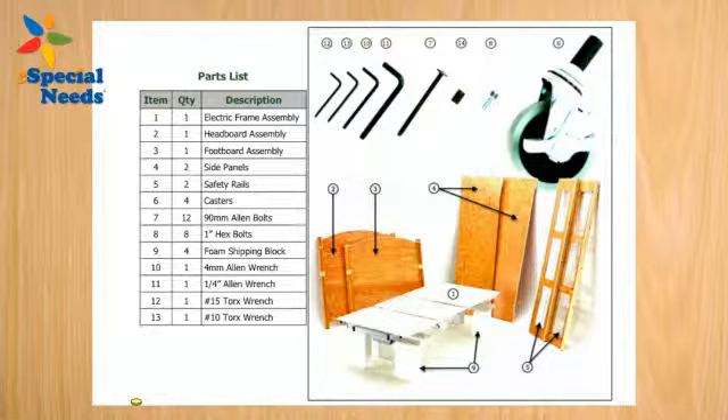Please take a moment and verify that all parts are included using the diagram shown on your screen. You may pause here if necessary. Now that you've verified that you have all the necessary parts, let's begin.